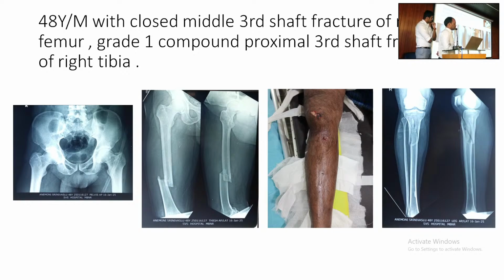If you want to do nailing, it is an expert nail. Otherwise, biological plating. Biological plating is ideal for such a metaphyseal fracture. Plating. Yes. Locking plate, 3-4 screws proximally and 3 screws distally. You don't need to open the fracture.